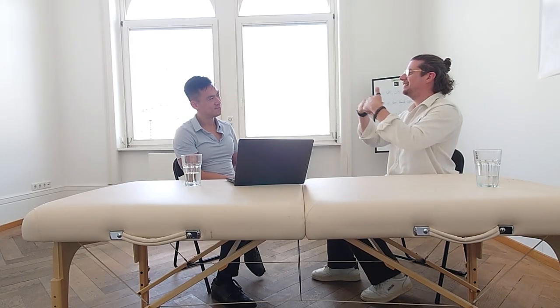Yeah. Alright? That doesn't make any sense. I want to check what his specific pattern is right now, and therefore I just let him go. And even if I tell him, hey, raise your arms, and he's doing the weirdest thing ever, it's his way of raising the arm, and this is what I want to measure, and then show him why it is not correct, and then fix it.